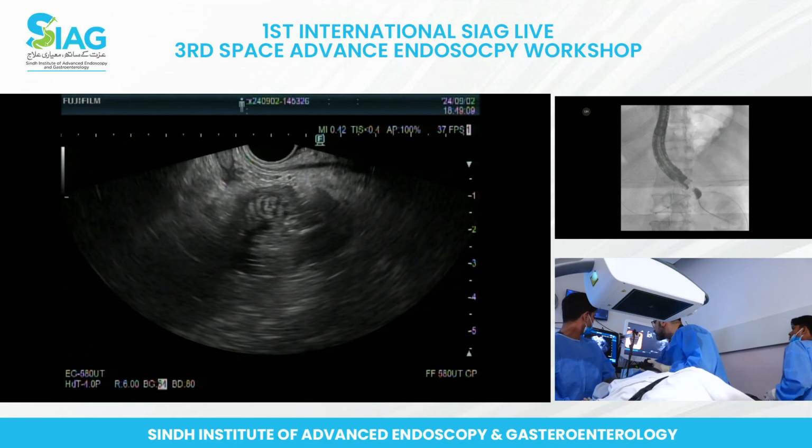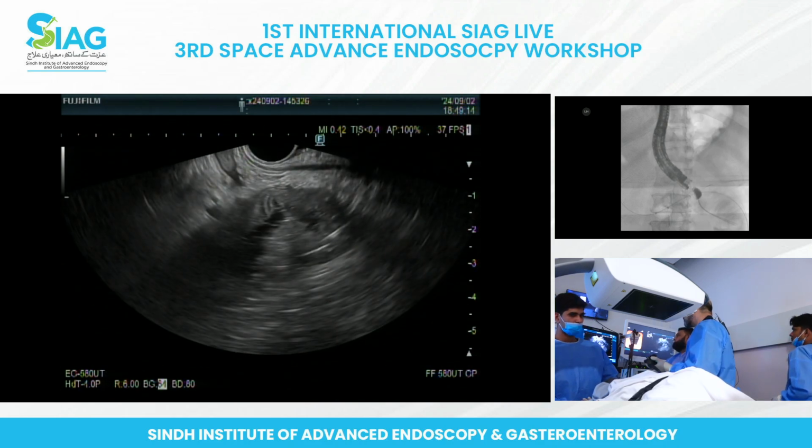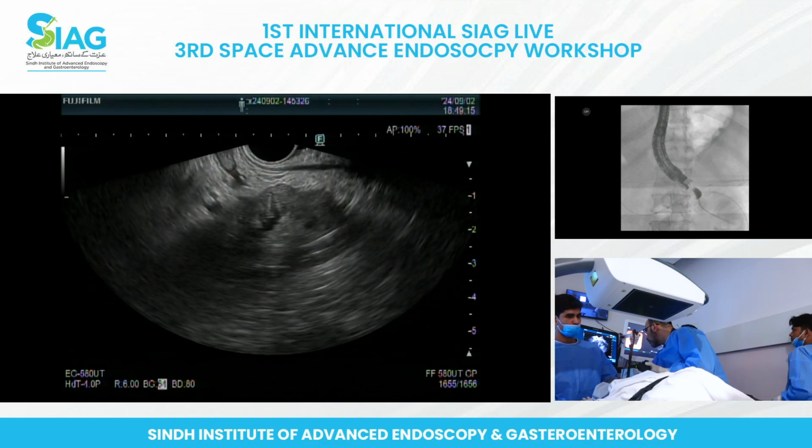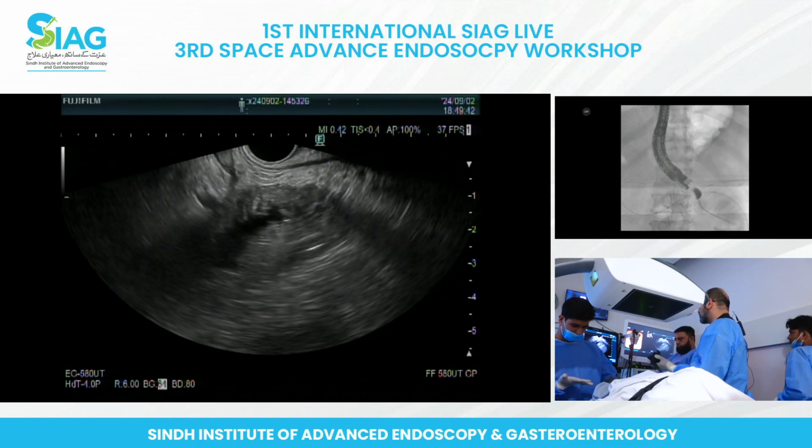So this is something we like to see in this situation where you have bowel that is going in the trajectory of the stent. The stent's going to come out like this. So if my bowel is going, I can see lumen coming this way. That gives me a longer landing space for my stent to come through. Because if you go cross-sectionally, then you have less space to deploy the stent. But if you can have it angling to the left of the screen, this is what we look for.